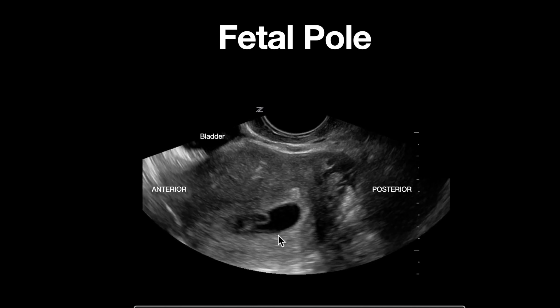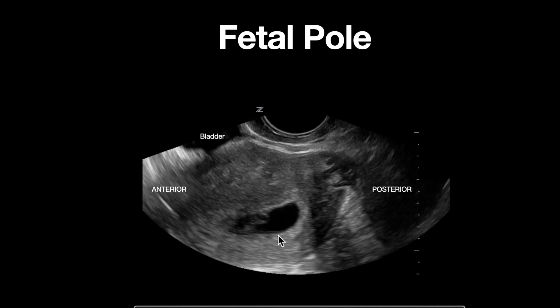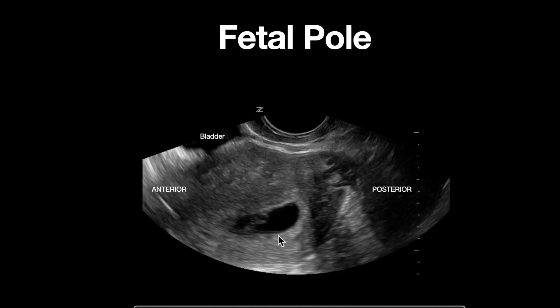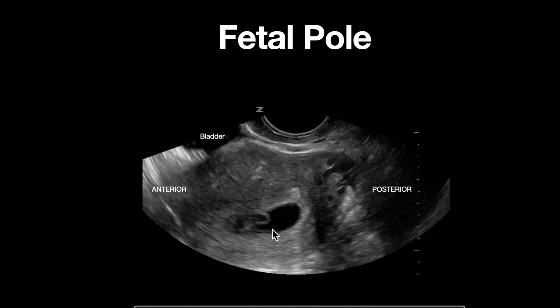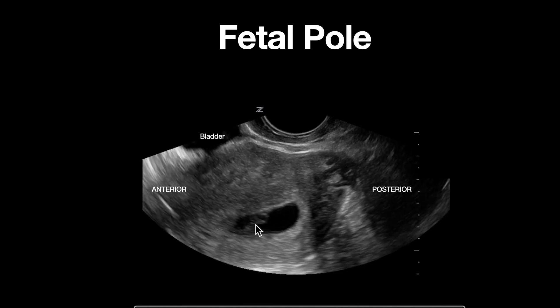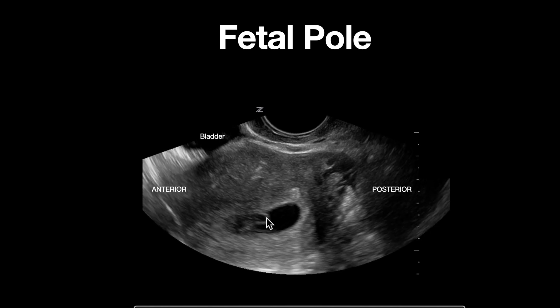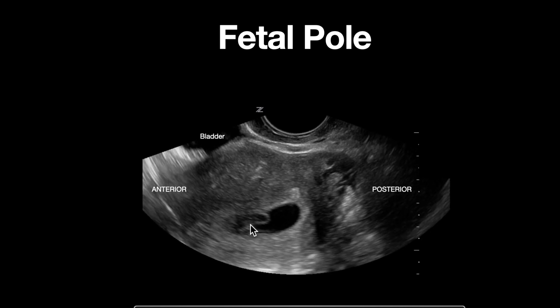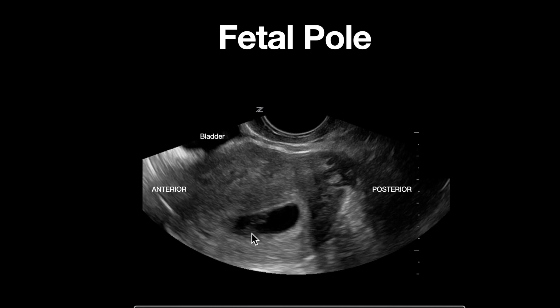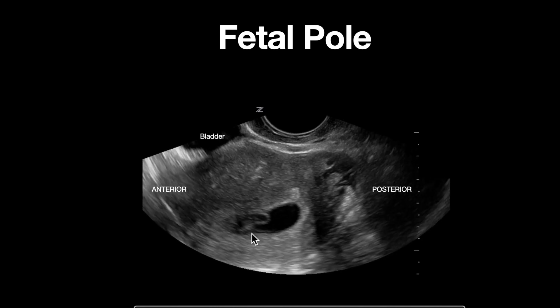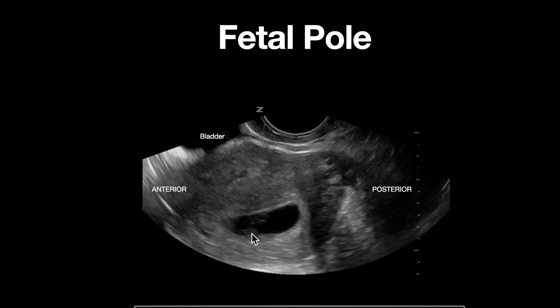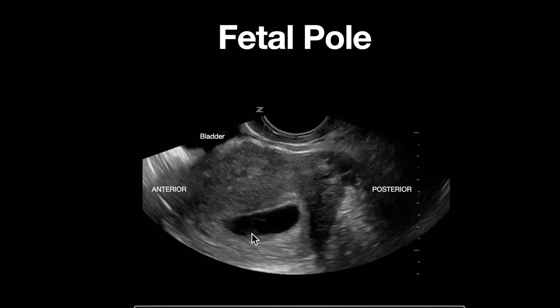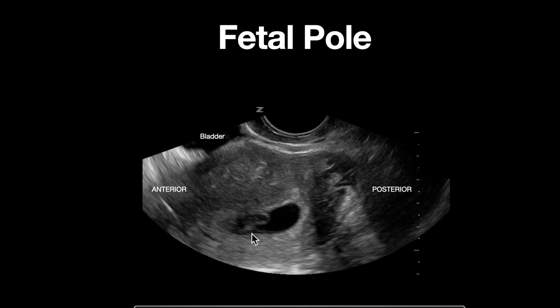We know that this is a gestational sac because we see the presence of two markers of a definitive IUP. A circular shape can be seen here, which is consistent with the yolk sac, and just abutting it we can see an isoechoic structure which is our fetal pole. Notice a flickering movement can be seen in the middle of the fetal pole, consistent with fetal cardiac activity.